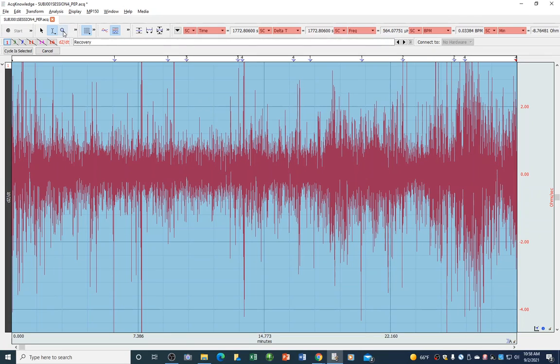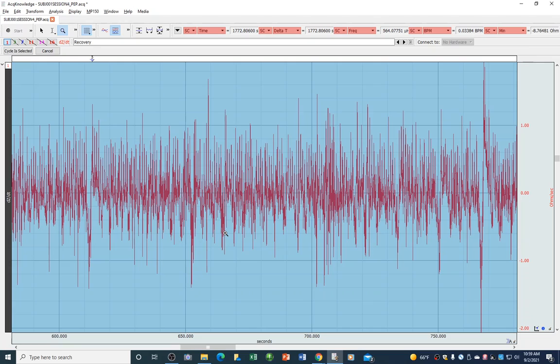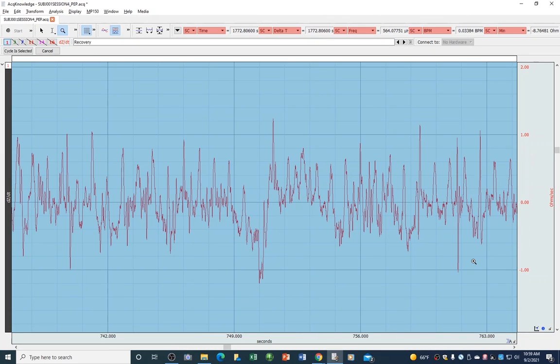So I'm going to get my zoom in tool, click on it so that that's what's active. And then I'm going to draw a rectangle around the relatively less fuzzy data, which is here. And I zoom in, but it still looks pretty fuzzy. So now I'm still looking for the least amount of fuzz, and I think I see some over here. So I'm going to zoom in a little more. It still looks fuzzy and gross. So we're going to do our best and see if there's anything useful in this signal.